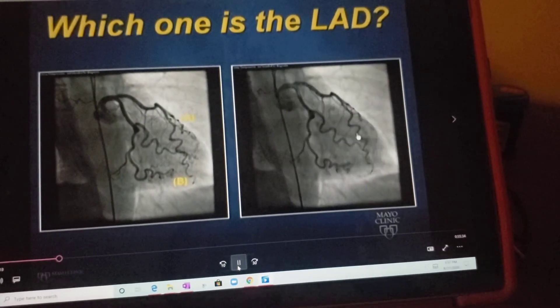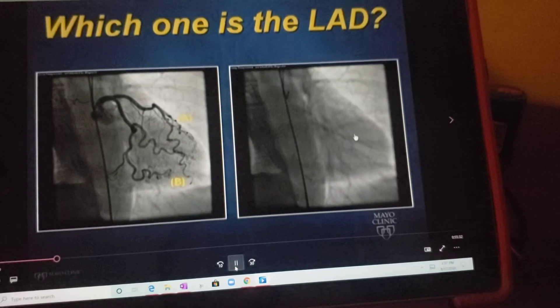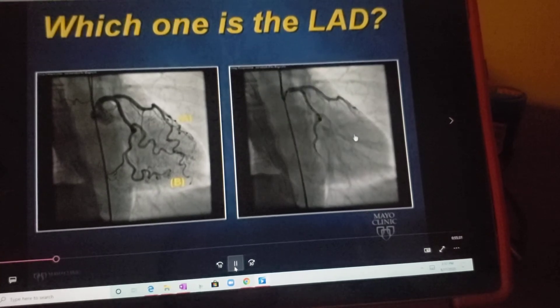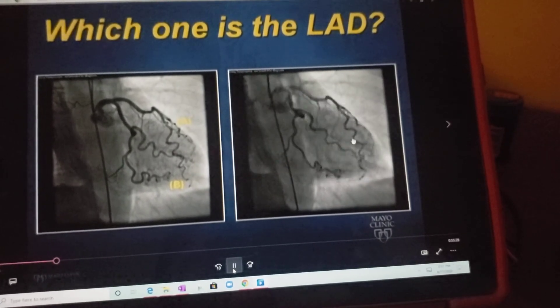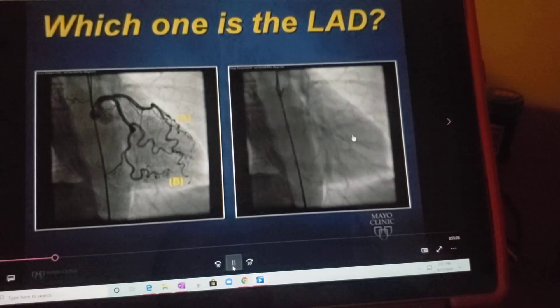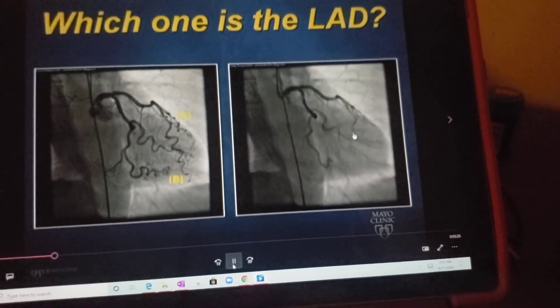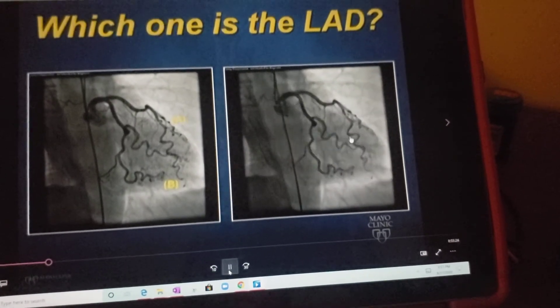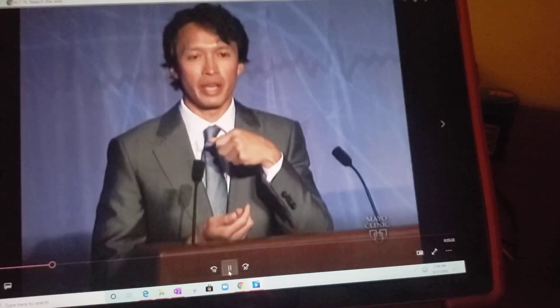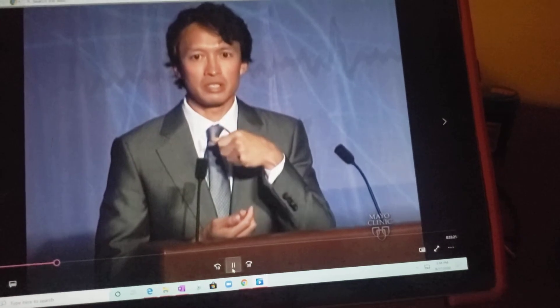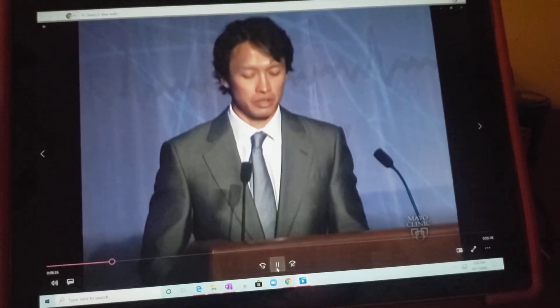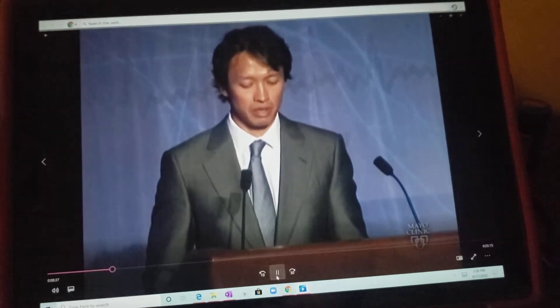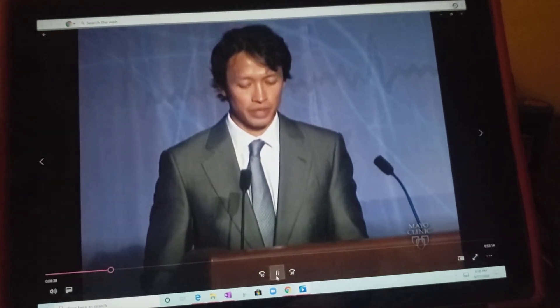That's because when the heart contracts, it rotates clockwise when you look from the head, and anything on the anterior surface is going to turn down, while anything on the inferior or lateral surface is going to go away. So the LAD typically goes in the opposite direction to your circumflex and inferior vessels. That's how you can tell that this vessel is the LAD.